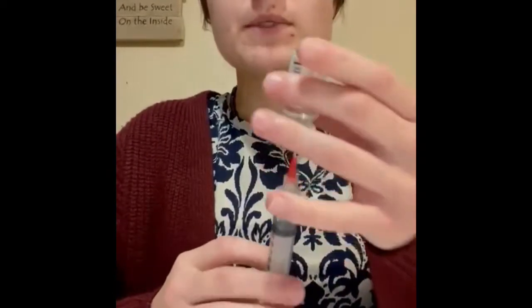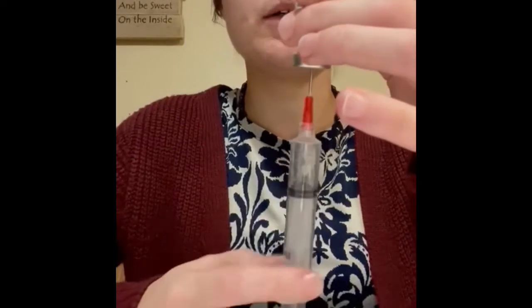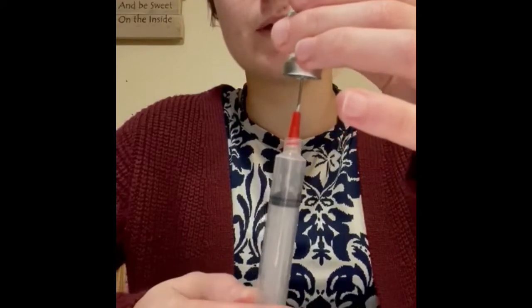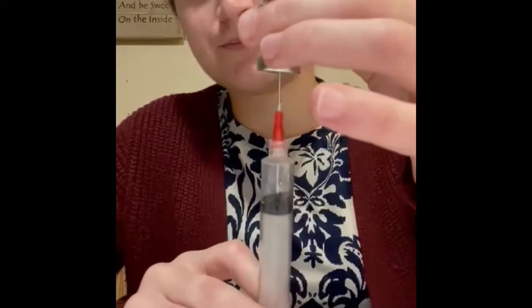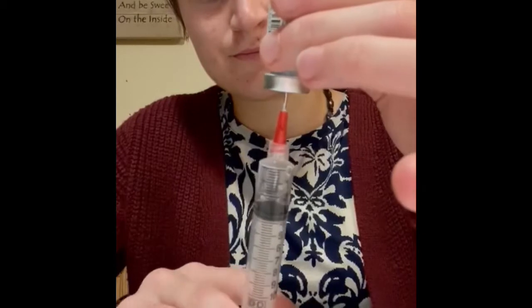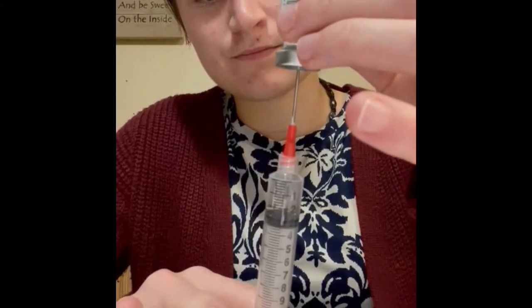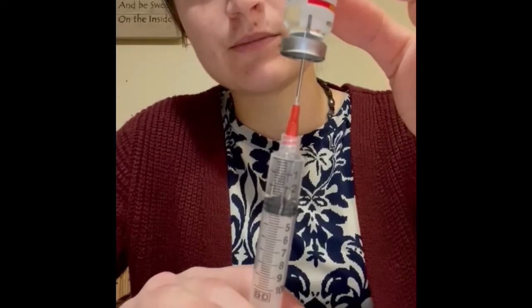I'm going to tip it upside down, and because it's a glass vial, it's not going to stretch, so just slowly work it in, little by little, until I see no more bubbles coming out of the top.